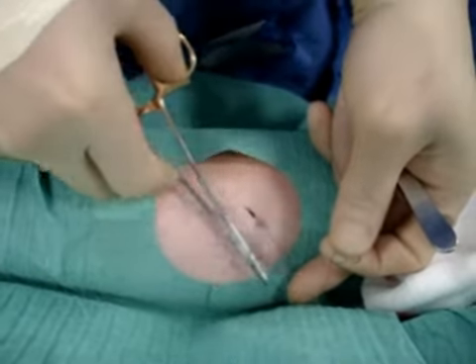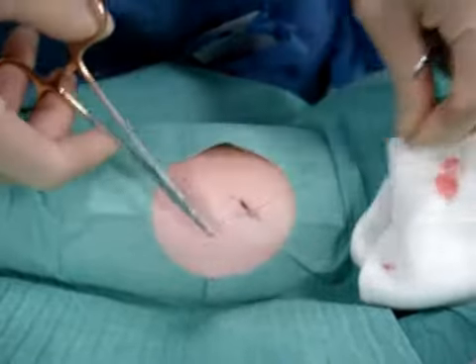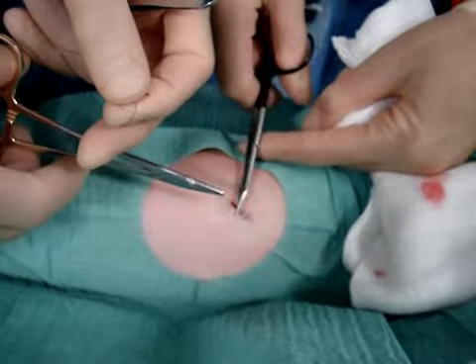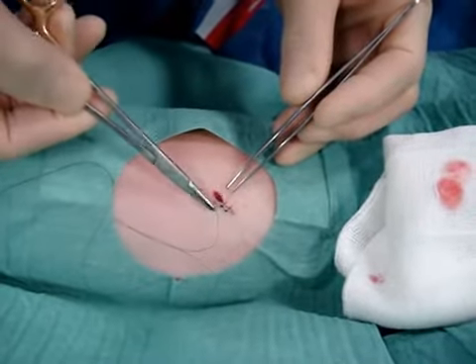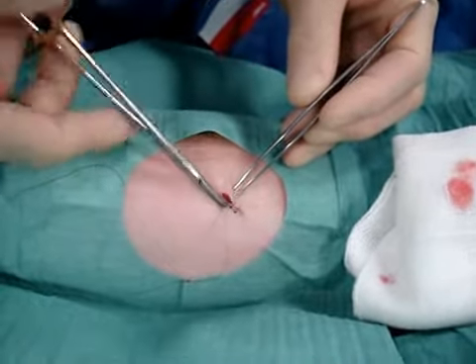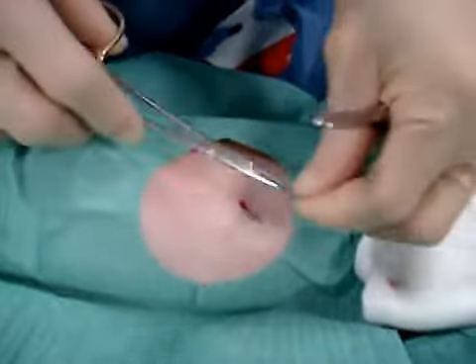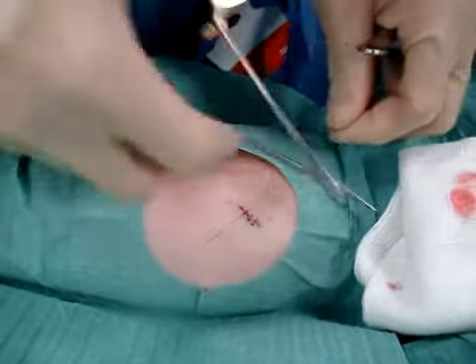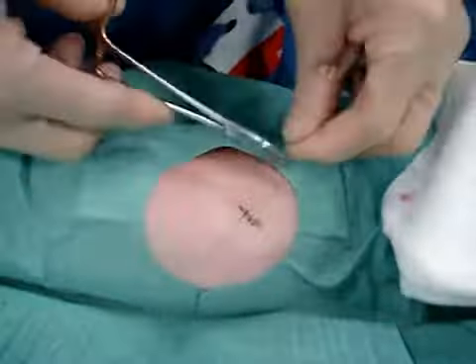If you need to stop it from slipping, just flick it to one side like that. Second knot, third knot — do it once more, same again. Double knot, then a single knot.